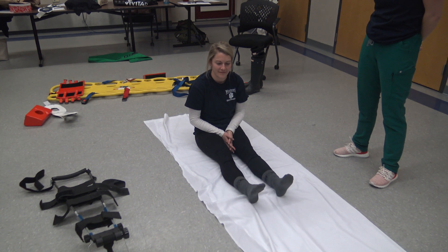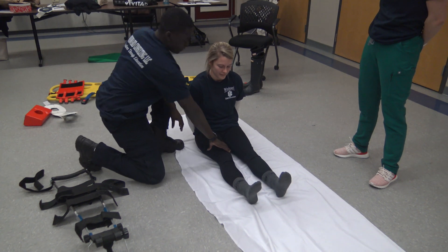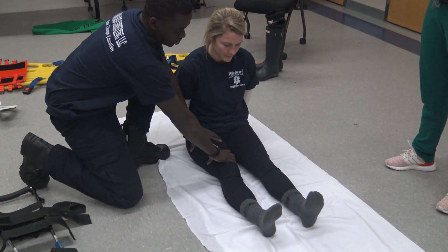Scene is safe, BSI is noted. First thing I'm going to do is take manual stabilization of the injury site. I'm going to do stabilization above and below the injury site.